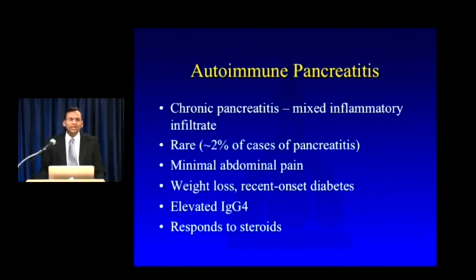I'd say that we see several of these every year, and we've saved several patients just in the course of the last 2 or 3 years that I know of that were thought to have either edematous pancreatitis or pancreatic cancer, and where we've been able to suggest autoimmune pancreatitis, and the patient really has been treated appropriately, whereas they might not have without the imaging.